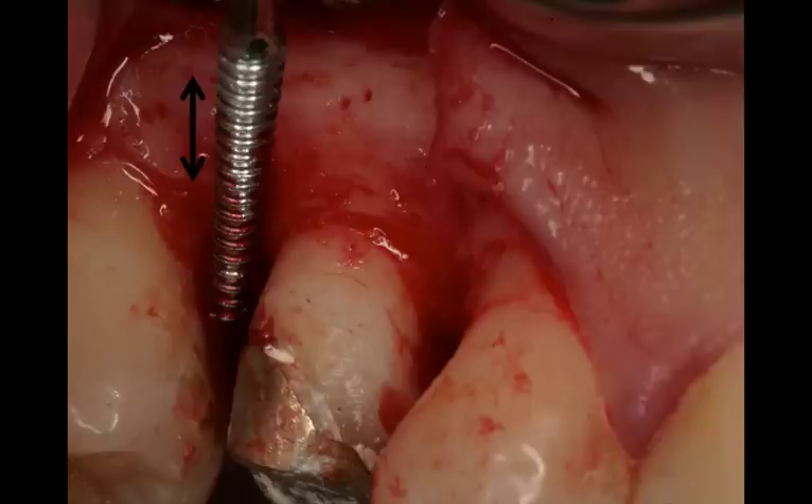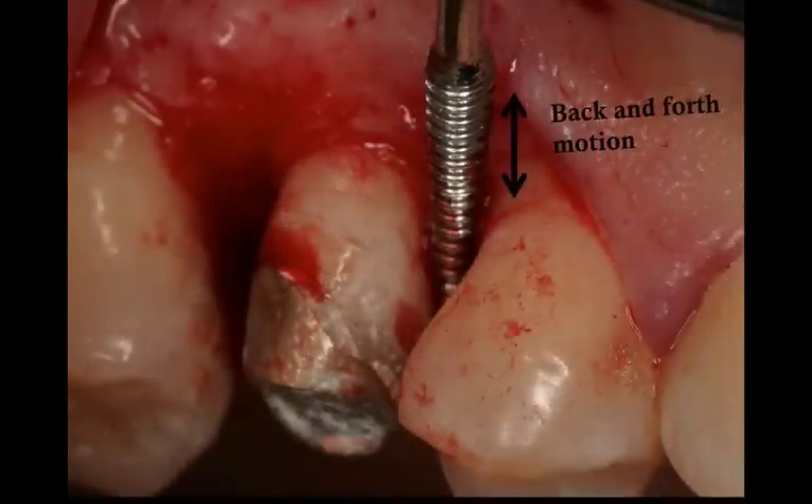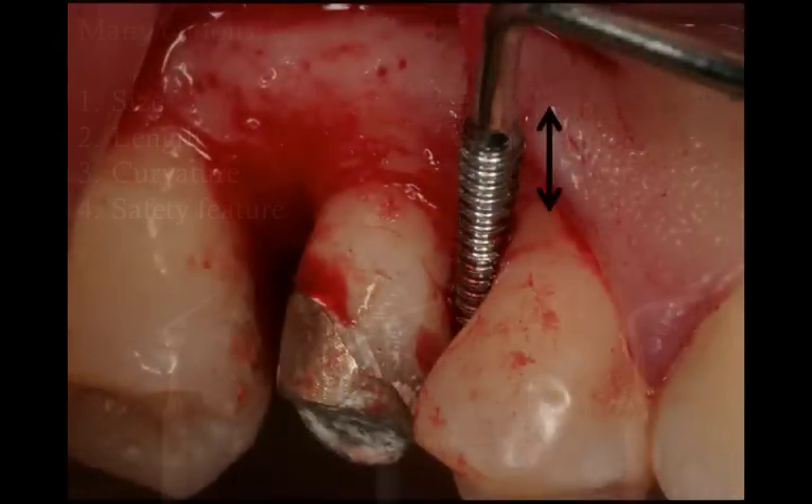Of course, it's not difficult to remove, but it may happen. And when you go back and forth, you can reduce the vertical height of bone interproximally. The best way to use it is to start with relatively small movements back and forth in and out in the interproximal area. And once you reduce some level of bone, the interproximal area obviously gets larger and then you can increase the motions for a safer reduction.